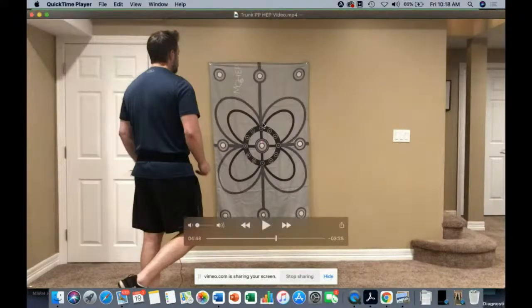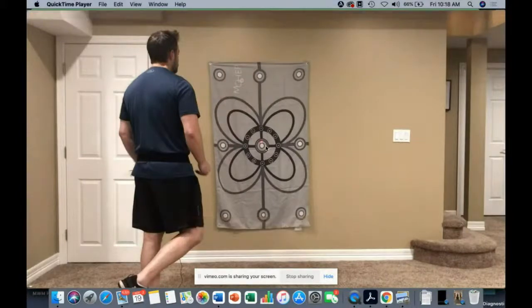So it could be this middle circle here, or it could be in a hemisphere or a quadrant on the flag, but actually starting to create some movement through that. So can we develop people's balance reaction mechanisms to also include the willingness to be able to move inside of those to control? So not just trying to hold things stable, but gaining control through movement.